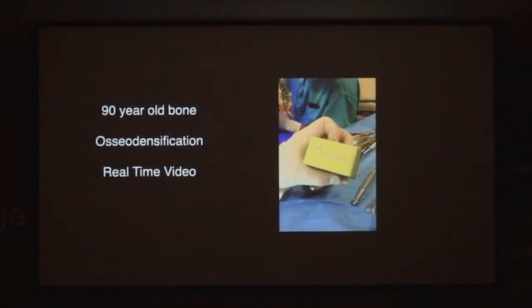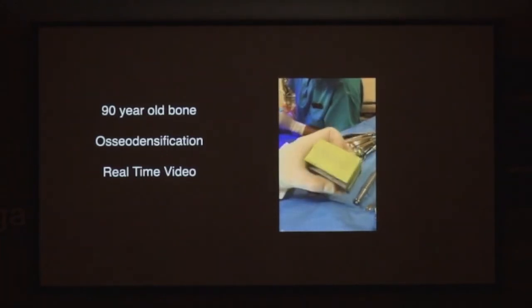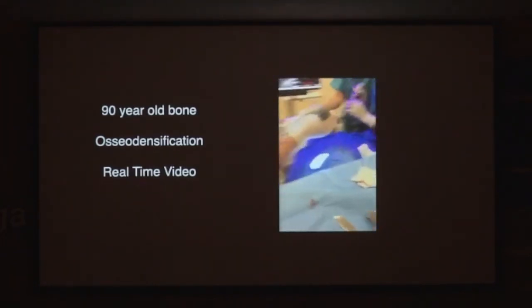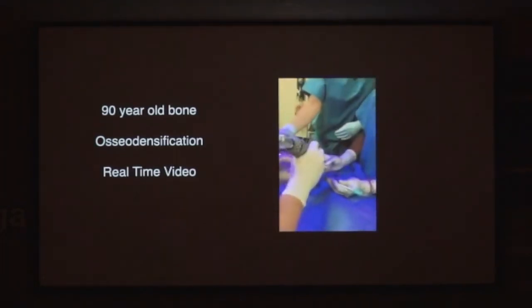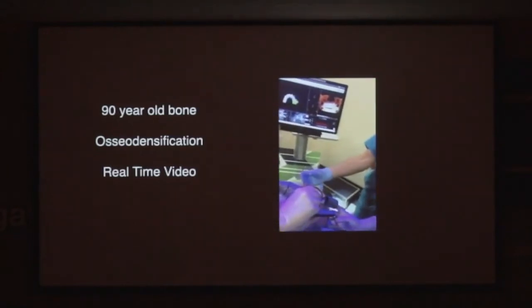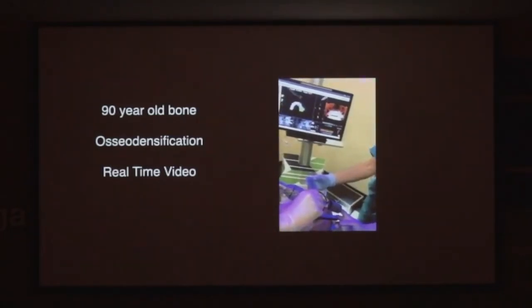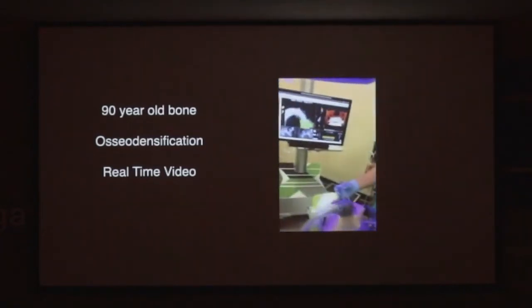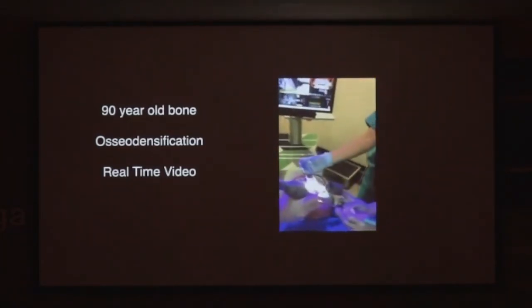Now, this is an unedited use of the densiburs. And the reason I say it's unedited is because it takes a couple of minutes. Now, I'm going to put in an implant on a 90-year-old guy. These are going to be loaded, and he's a bruxer. Show me measuring the densibur. I just measured it. Now I'm going to put it on reverse. So you run these burs in reverse when you want to densify.